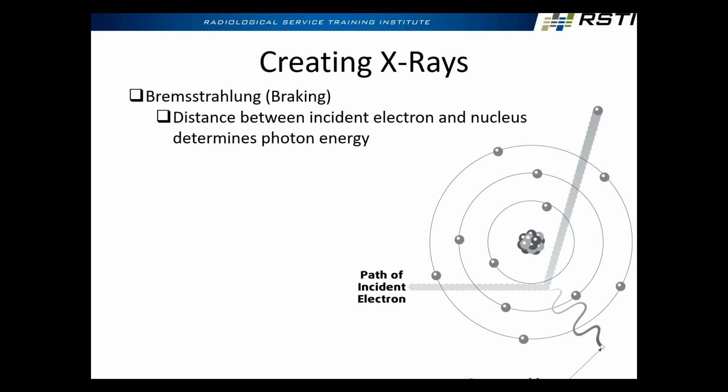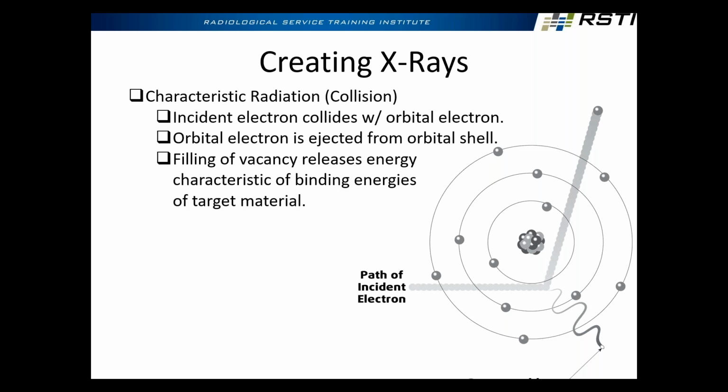So what happens to that electron? Oh, nobody said there was going to be a quiz. Here's a question. What do we do in electronics? We push electrons around, right? We give them potential, we take it away, we make them do work. Nothing happens to that electron. It continues on as part of the circuit. The only thing that happened in that X-ray tube was we generated an electron, we gave it a bunch of kinetic energy, and we threw it at something. When it hit that thing, it gave it all up, either in the form of heat or, in some teeny tiny fraction, the production of some X-rays. So that's one type.